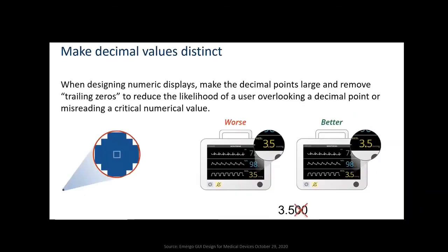I don't want to distract too much from your good pace that you're going. I just wanted to reiterate that point that you made about software doing parameter checking on displayed parameters. That's a real key design element to defensive software programming, so that you ensure that any parameter that is used, regardless of whether it's displayed or whether it's being used for some kind of additional action, is range checked and has an acceptable range before it actually gets used. So that's a real good point to make there.